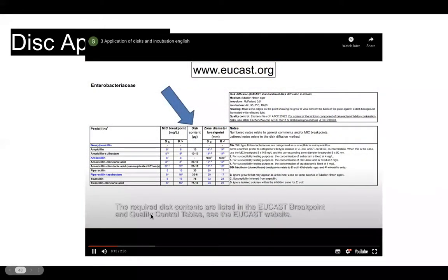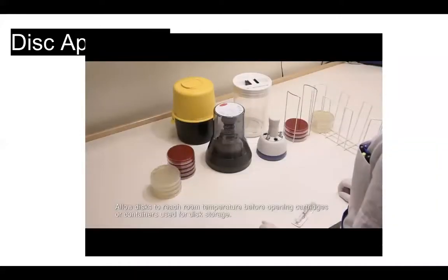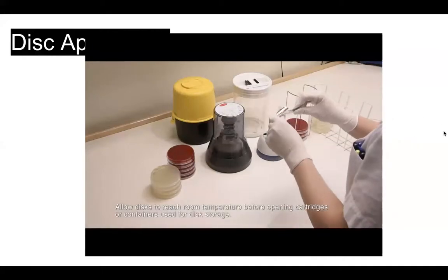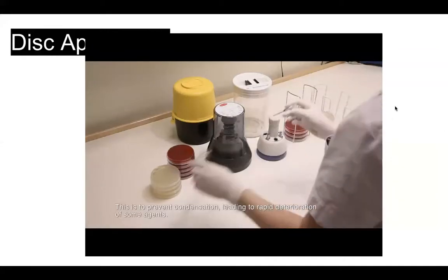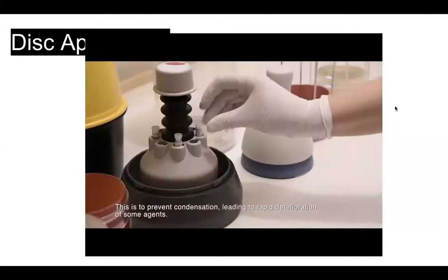The required disc contents are listed in the EUCAST breakpoint and quality control tables available on the EUCAST website, a really useful website. Allow discs to reach room temperature before opening cartridges and containers used for disc storage. This is to prevent condensation, leading to rapid deterioration of some agents.